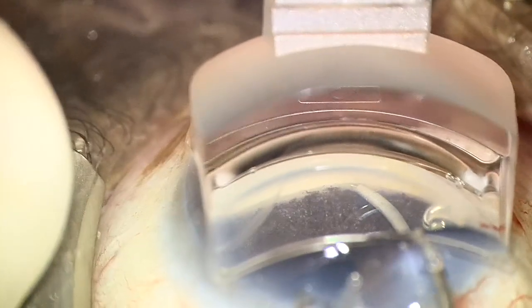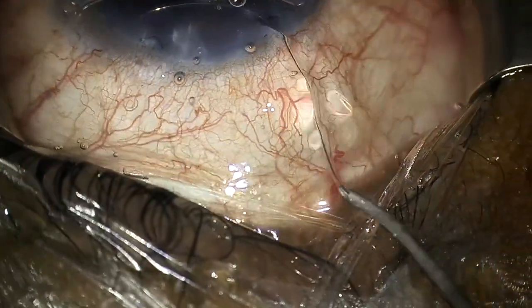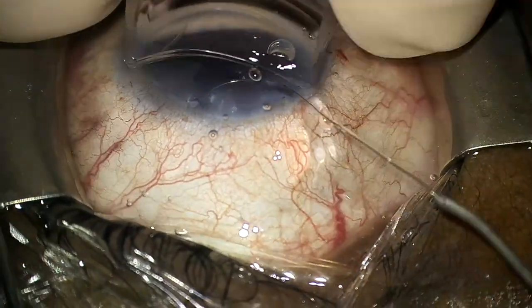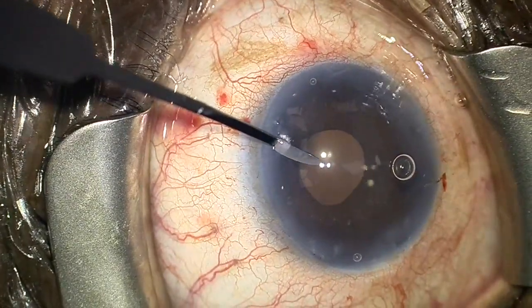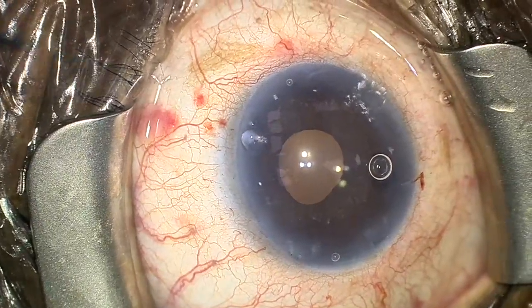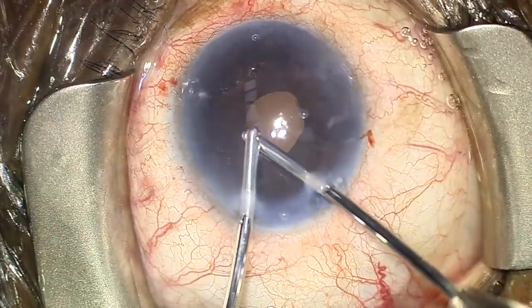After 10 o'clock hours, an obstruction is reached and the catheter cannot be pushed forward any further, so the entire handpiece and catheter are pulled straight out of the paracentesis, which accomplishes a 270-degree goniotomy in this case. There is helon trapped in the area of the Descemet's detachment, so a venting stab is made to help it escape.